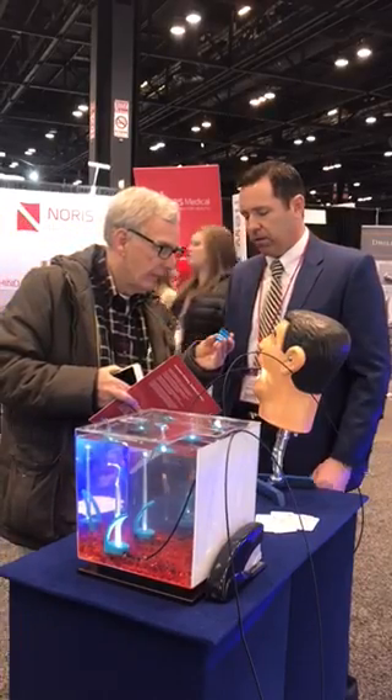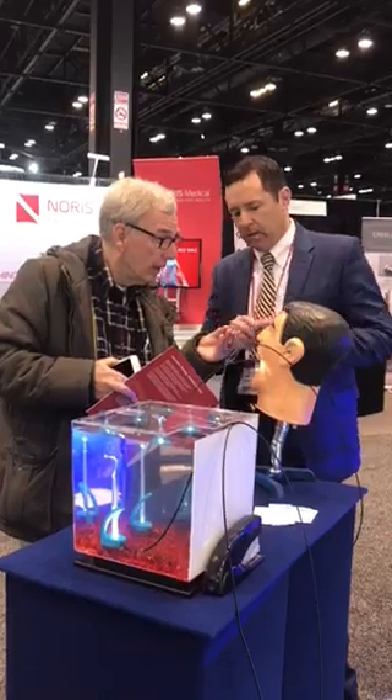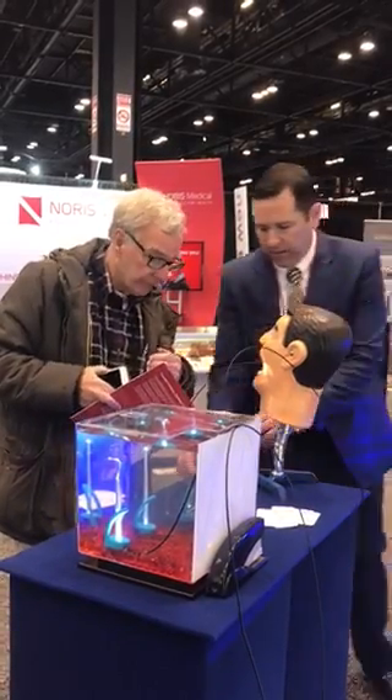We embed a magnet in there, so it attracts the... So when you grab one of these pieces, it attracts together.